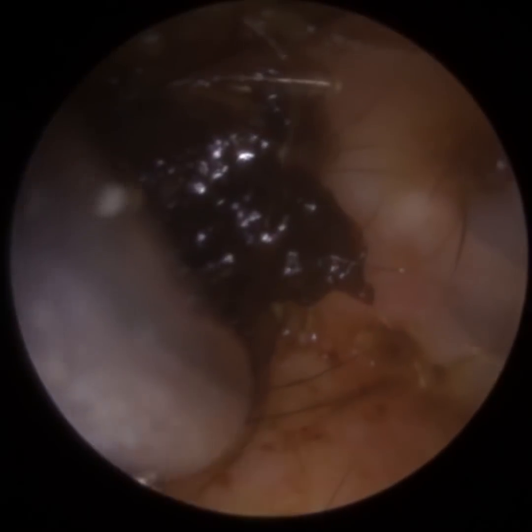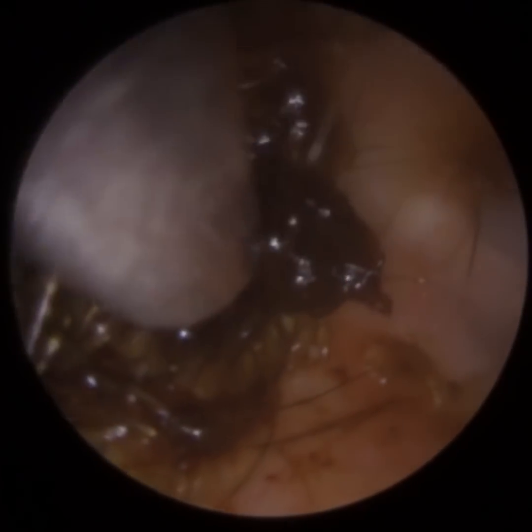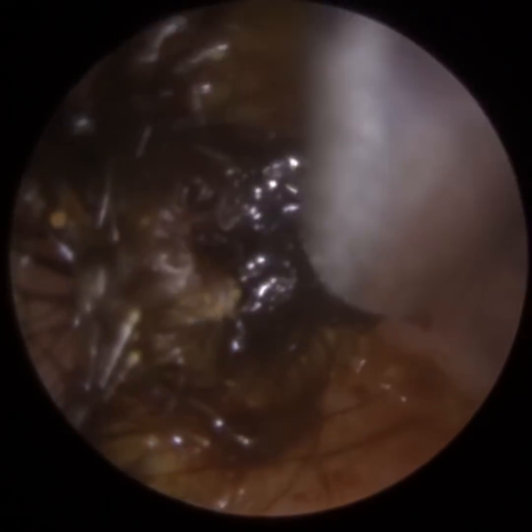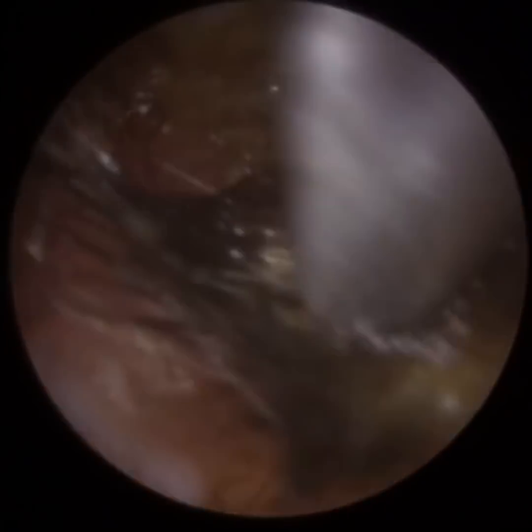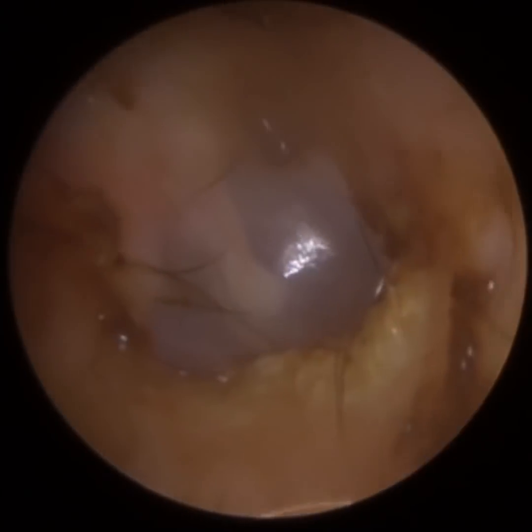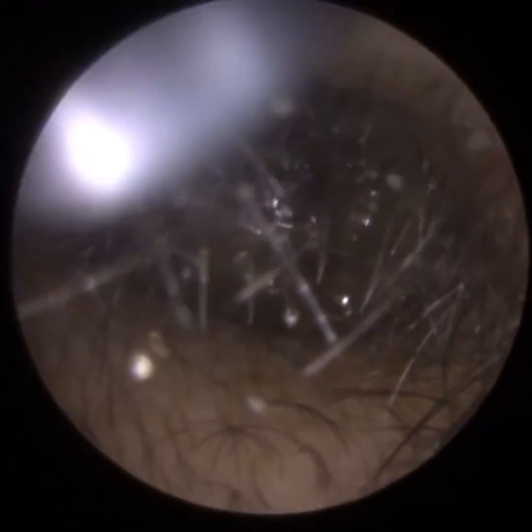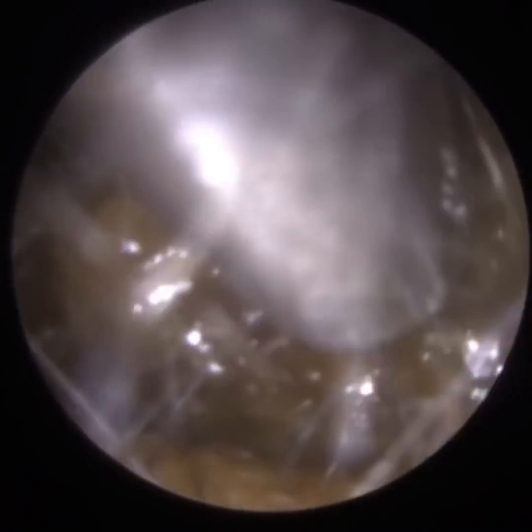The ear canal narrows and then protrudes back out sideways and outwards. The ear's clear now, just some residual wax on the posterior canal wall. It's matted — you can see the hair strands there, another indication that the patient has been using Q-tips, pushing loose hairs into the ear. It got a bit smeary as we went in because the patient had been using some olive oil drops prior to attending, but the eardrum is nice and clear.